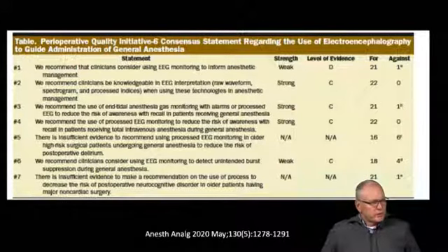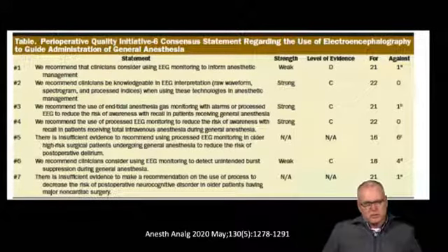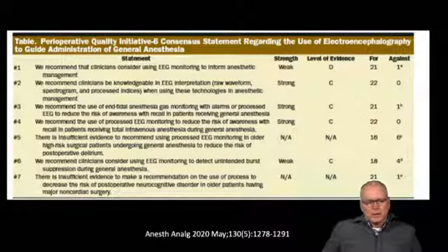I think the take-homes here are, it's reasonable to expect of us as anesthesiologists to have a working knowledge of processed EEG, the raw EEG, how the EEG changes, awake versus general, knowing when the EEG is showing signs of brain strain, if you will, with burst suppression and isoelectricity, knowing where to look on the monitor to detect that burst suppression, knowing where to look to see a decrease in the alpha frequency band power, and making adjustments as needed.